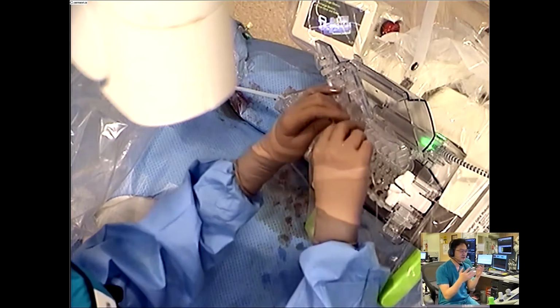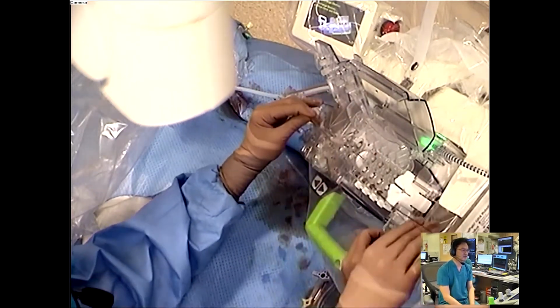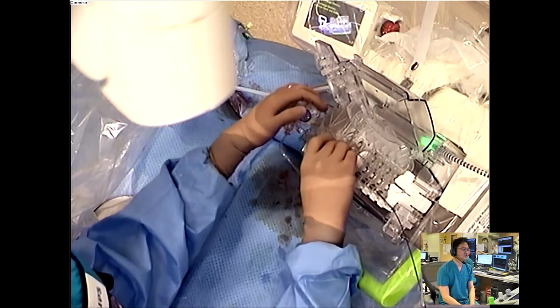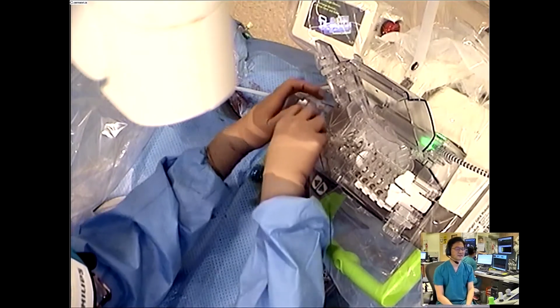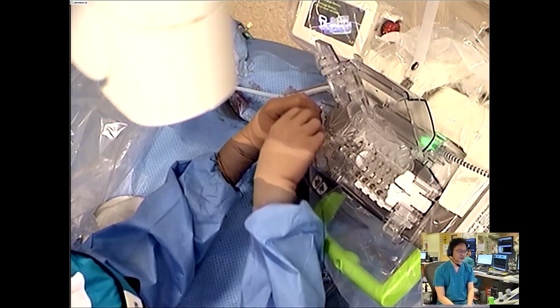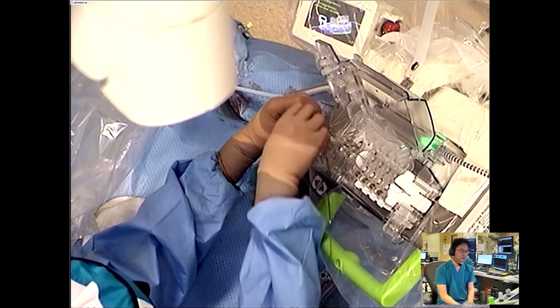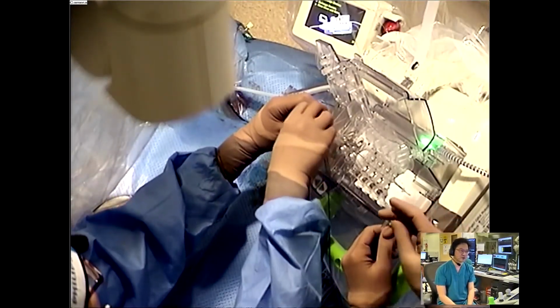The devices are pushed in by a lot of pulleys and gears and all that. So if things are too delicate, it will crush them. Therefore, things like OCT and some of the Boston IVUS are not compatible with this system. The robot will just chew it up. The Volcano IVUS is a little bit more robust, so it has no problem tolerating it.